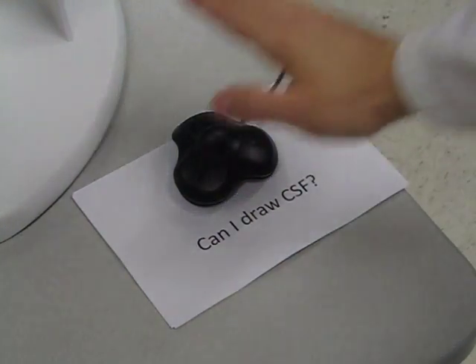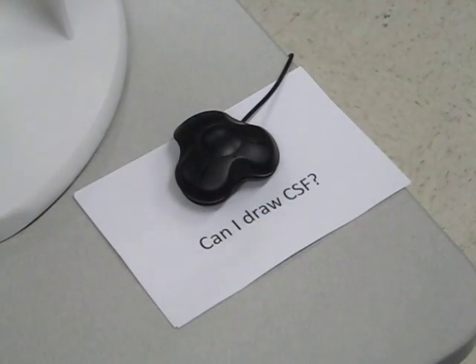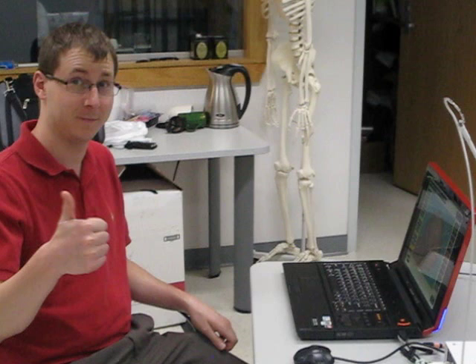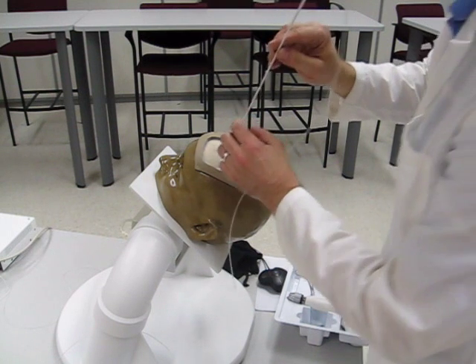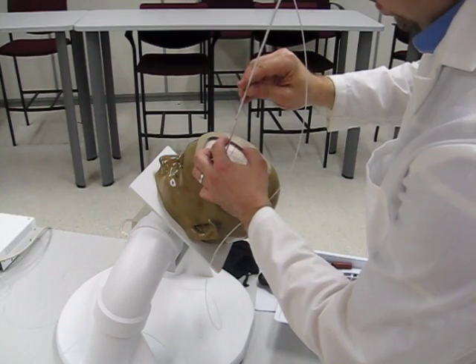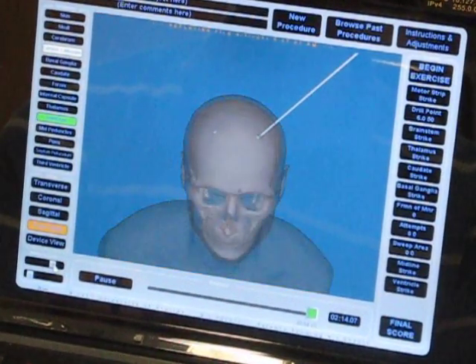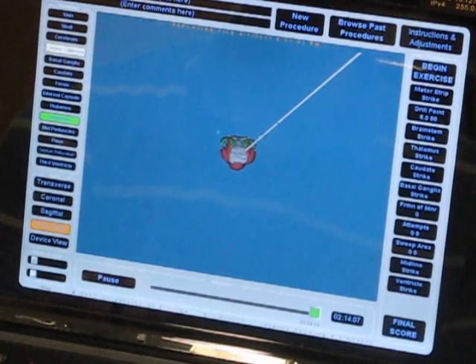Press the button that says 'Do I get CSF?' and the simulation will let you know if you can or cannot draw CSF. If you can, you are done. If not, you may remove the catheter completely and try again. When you are finished, we can perform an after action review and see your procedure from a perspective inside the brain.